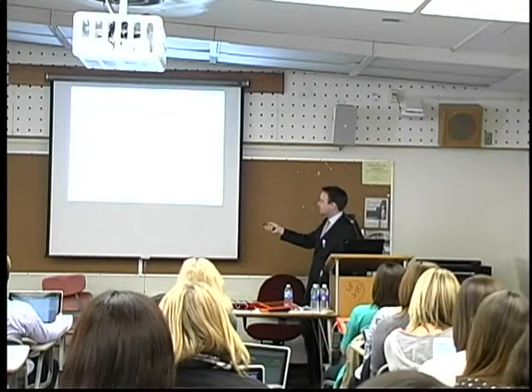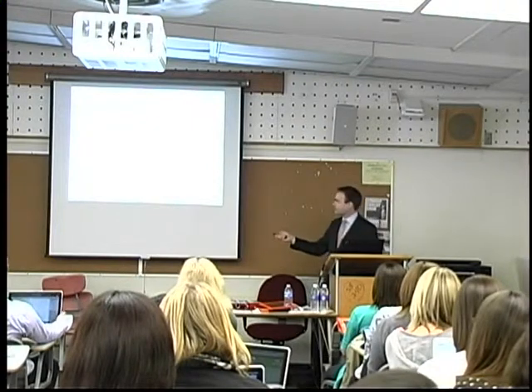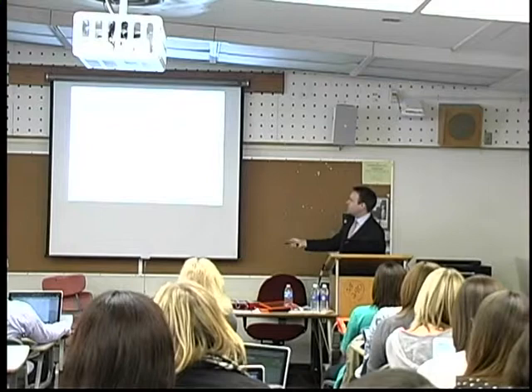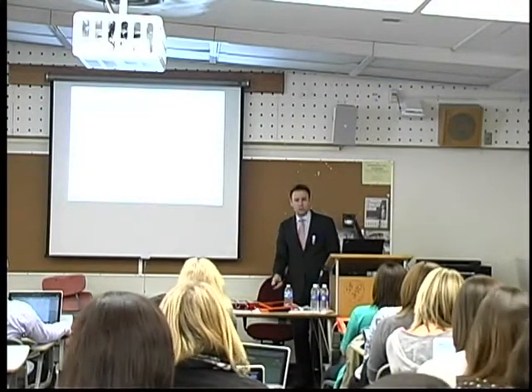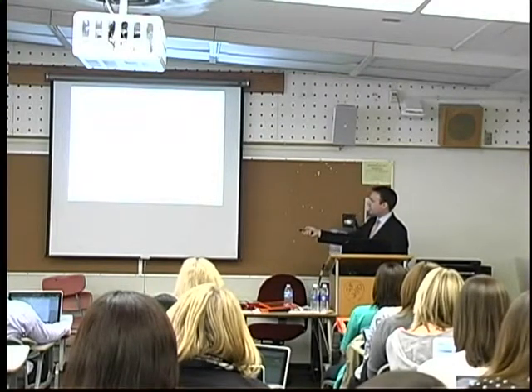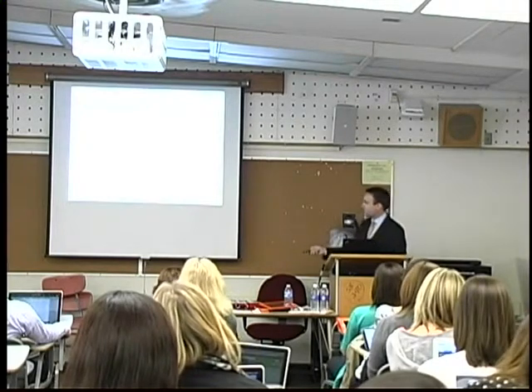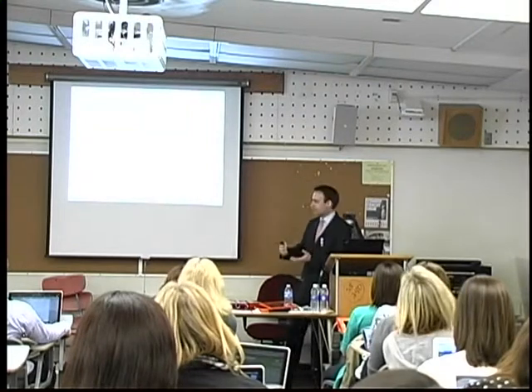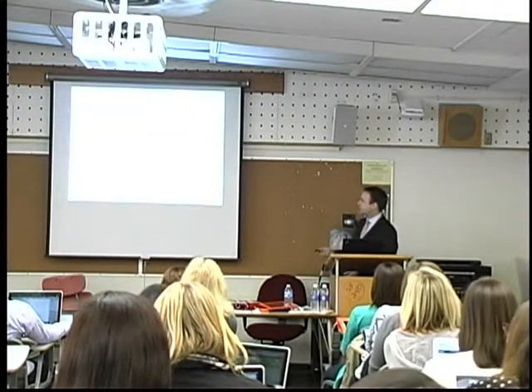We were then interested, when doing such a modified PECS protocol, what are the effects on teaching individuals to request, to improve their social communicative behaviors, and does this also have a facilitating effect on natural speech production? At this point in time, we were interested in a particular device that was built for such purposes. That was really the first hardware attempt to mimic PECS and combine PECS with speech output, and I'll show that device in a little bit.